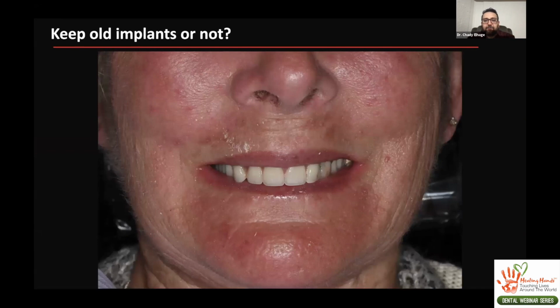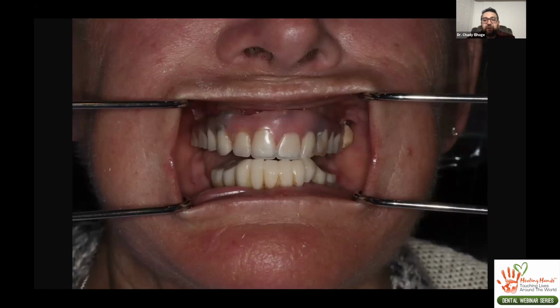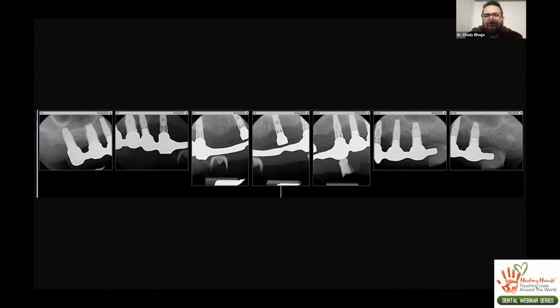This was an example of a patient who had a full arch restoration that was completed. This is interesting because she had an upper hybrid done. They built a flange, and then they also restored it in a class 2 deep bite. So you can see this is a very destructive bite. You can look at the bottom and you can see the wear pattern on the bottom and how things were fitting together. So we take a series of x-rays. She's got, I think, 8 or 9 implants. All of them have crestal bone loss, 25% bone loss or so.